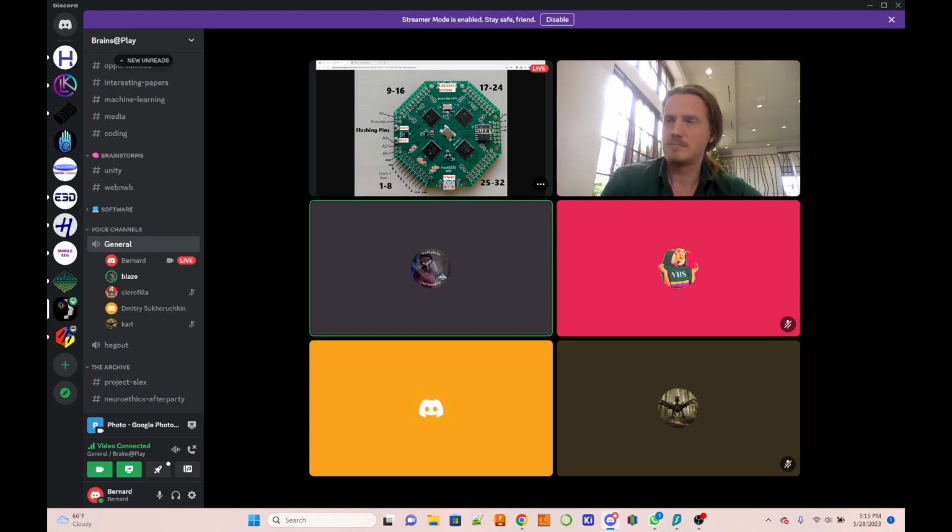Whereas here, the positives are on the outside, which I've got the pre-soldered ones, so they're on the bottom. So I'm still plugging my signal into the bottom, except it's going into the positive pin rather than the negative pin. That makes sense. I'm wiring it the same way, but I'm actually putting it into the red lead on your multimeter, which makes more sense to me. Unless I've got that the wrong way around again, but I can check my notes.